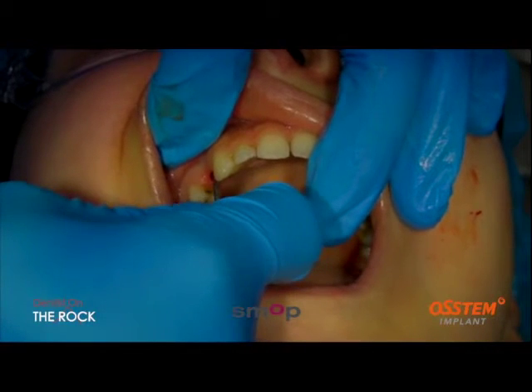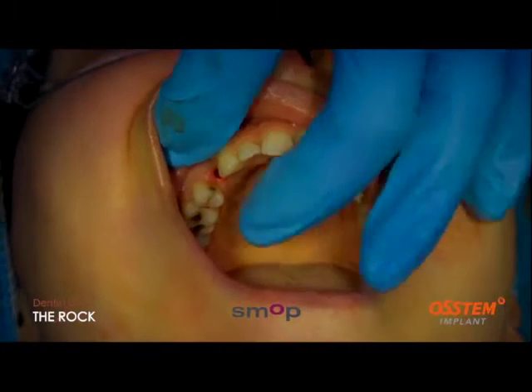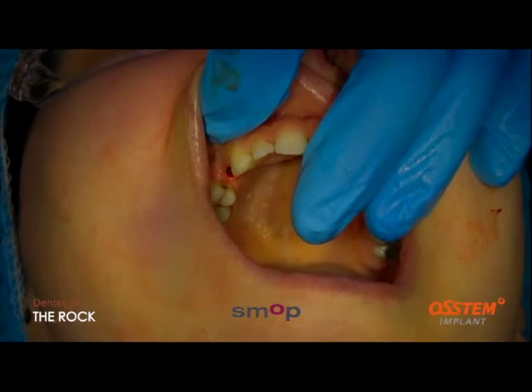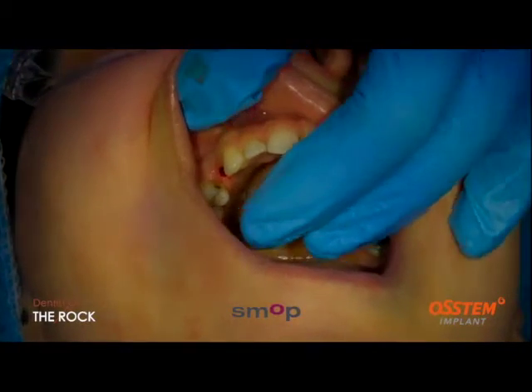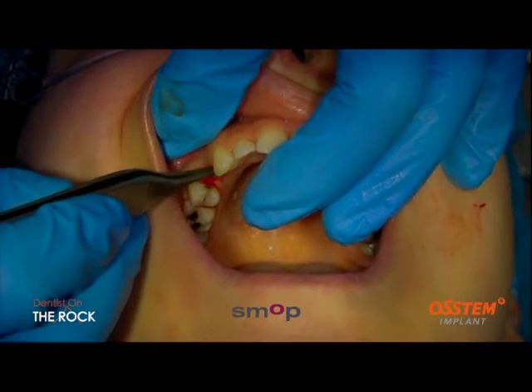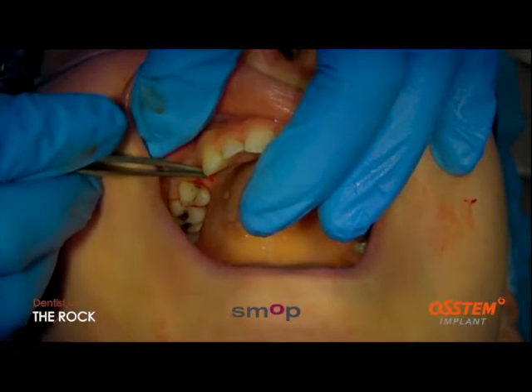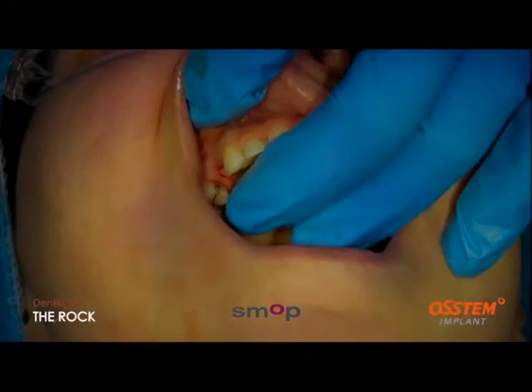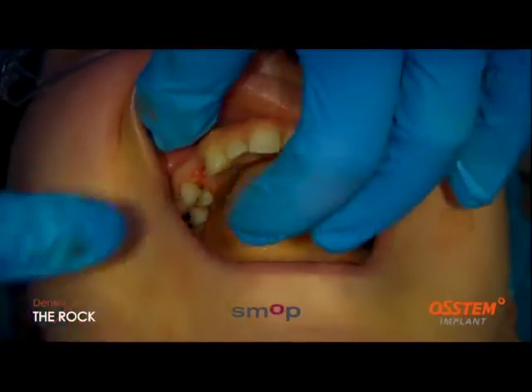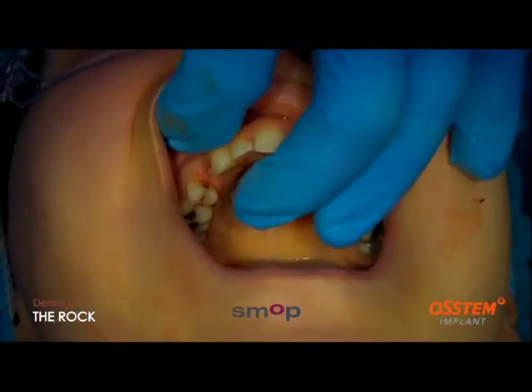Just hand tighten that a little bit. That's lovely. And then this is my personal preference. You don't have to do this, you could use a healing abutment, but because I want extra soft tissue, I'm basically using the soft tissue plug. So I'm a big fan, I like Periacryl. It only lasts a week or two, but it saves a lot of harm with the tissue. And it seals it very nicely.